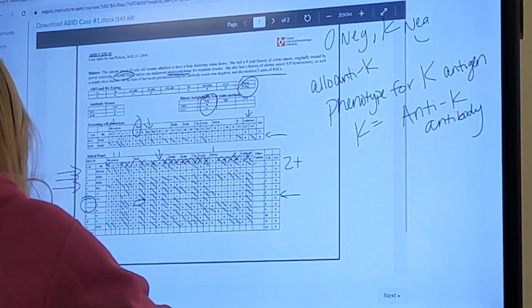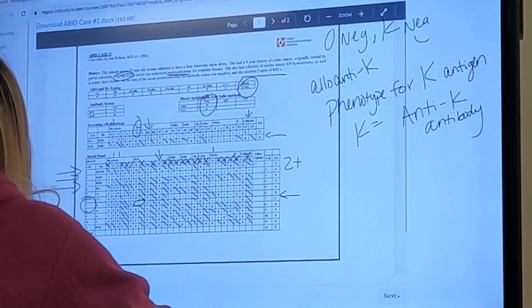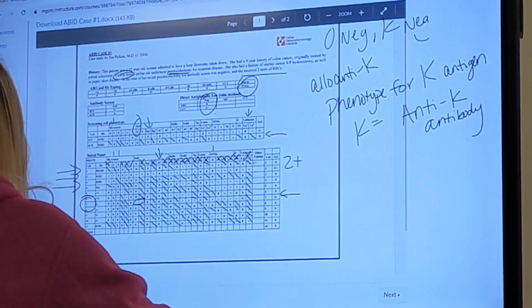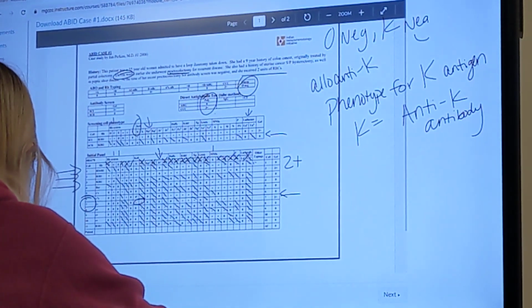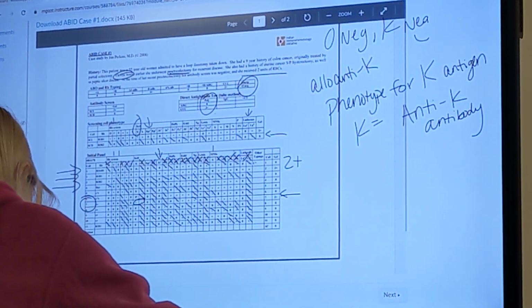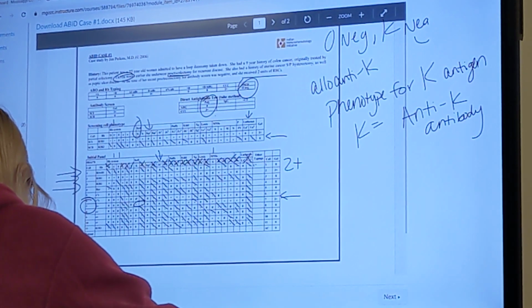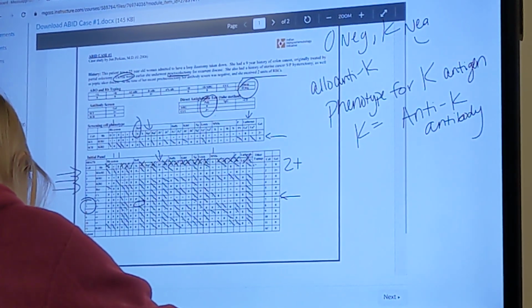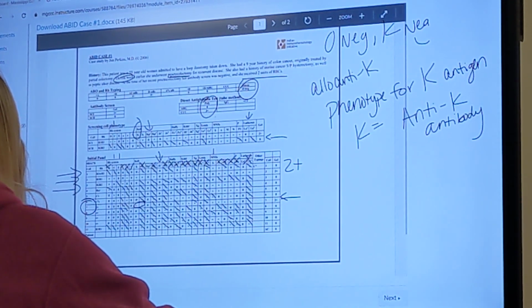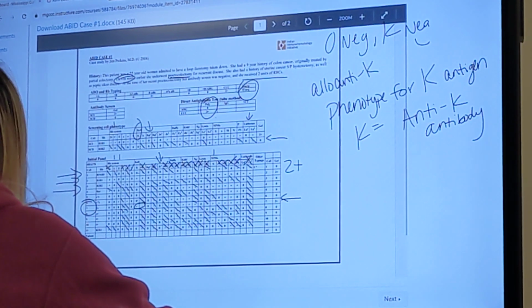So now when you go and do homework, it will help it stick in your brain. What are we going to do with that antigen phenotype on the second one, the homework one? It doesn't say anything else. I haven't looked at homework since last year. It's the antigen phenotype, it only says absolutely C, nothing else. So she's 25 years old and she's RH negative. Never been transfused. But, with a spontaneous abortion, which means it just randomly happens, the baby dies.